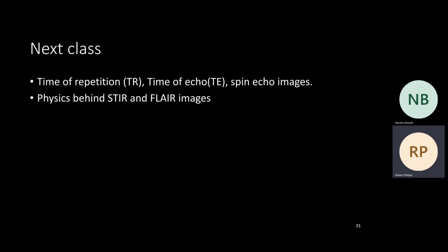Usually proton density is used for tumor again, soft tissue tumor. To differentiate from non-malignant benign inflammatory regions, for example, inflammation. Whenever we're saying proton here in the context of MRI, it's water, mostly water.